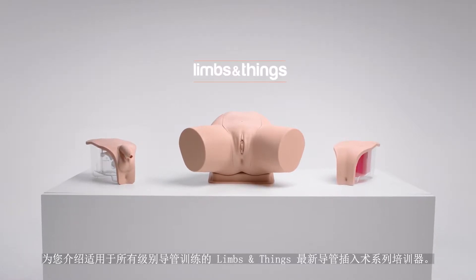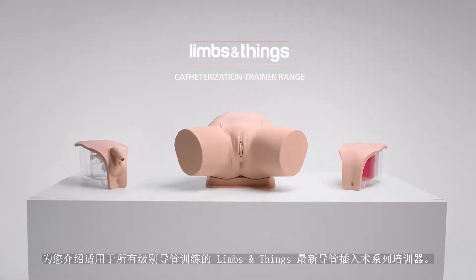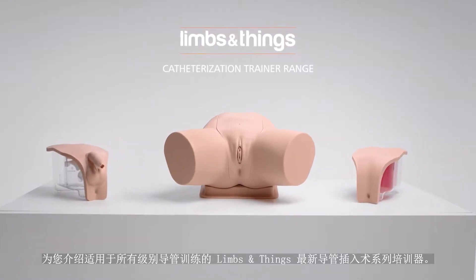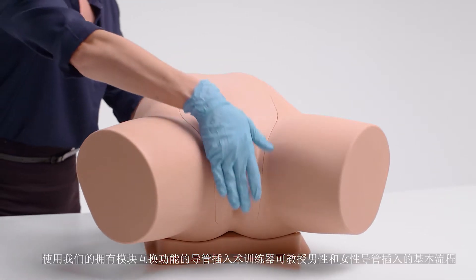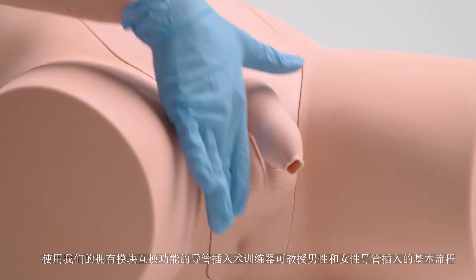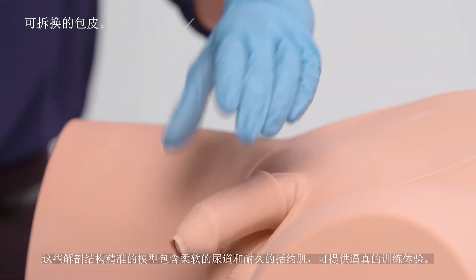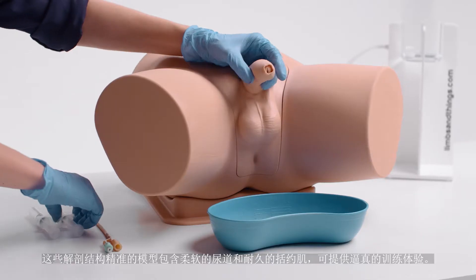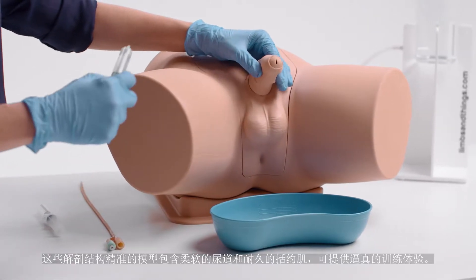Introducing the latest urinary catheterization range from Limbs & Things that caters for all levels of catheterization training. The fundamental procedure of male and female catheterization can be taught using our interchangeable modules. The anatomically accurate modules include a supple urethra and resistant sphincter, providing a closer-to-life training experience.